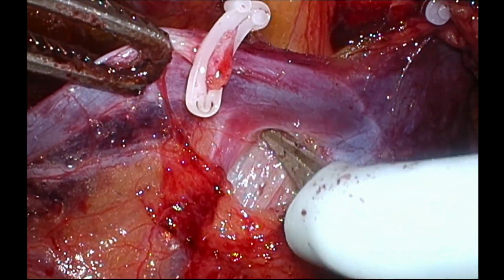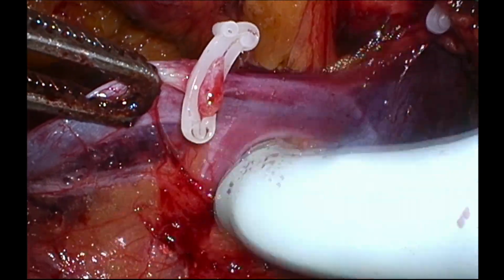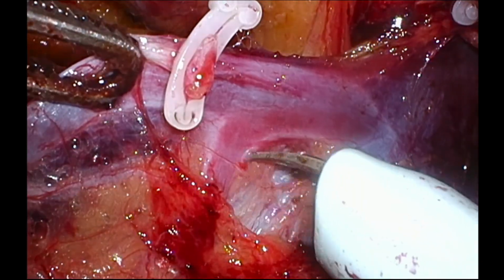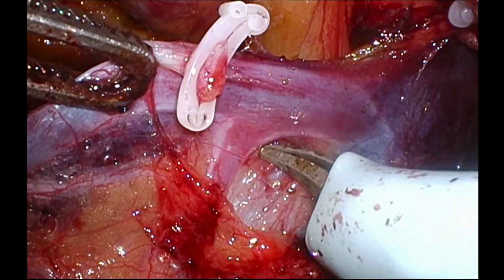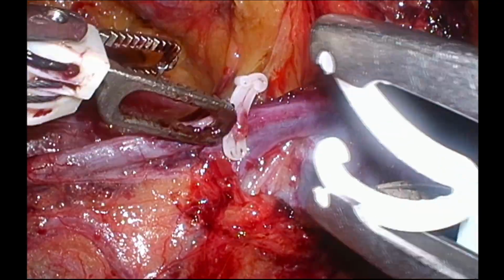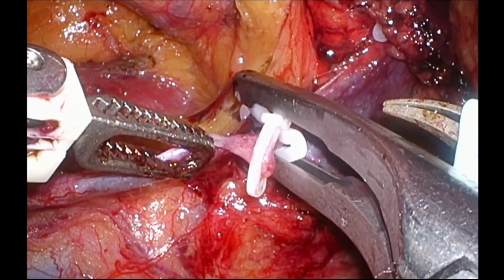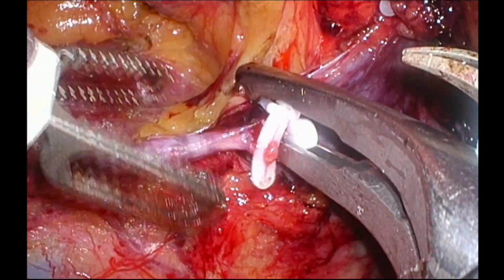One can appreciate unusual insertion of right gonadal vein at the junction of renal vein with IVC. Gonadal vein is cut at its insertion between the clips. This allows increased exposure at renal hilum.